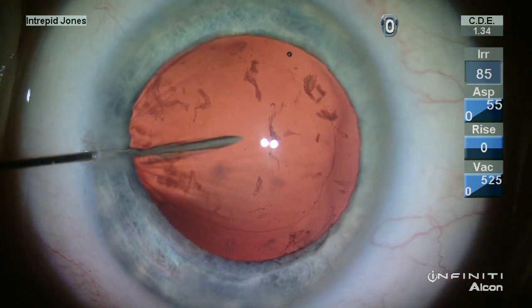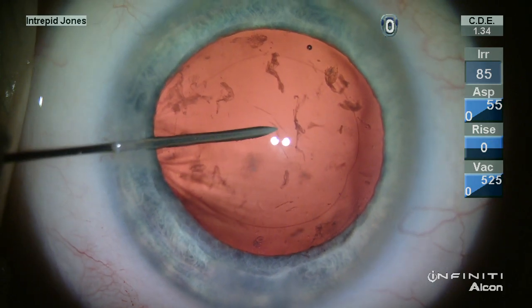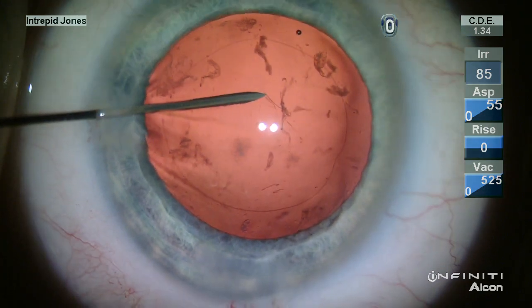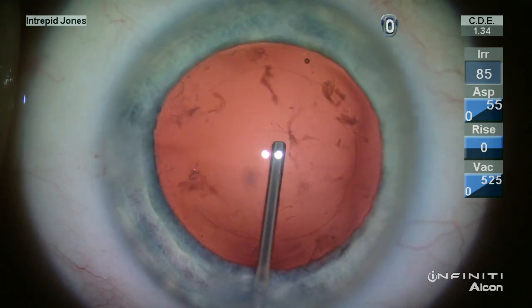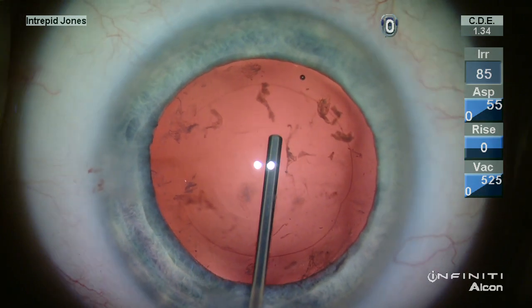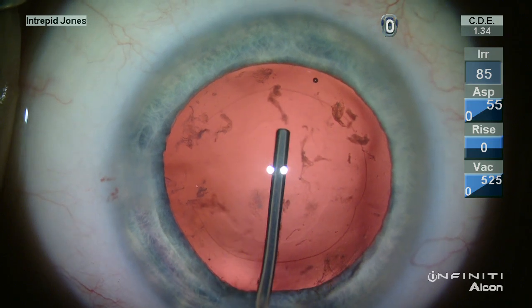You can visualize the liberated material here. Switching to the stereo coaxial illumination on the Lumera microscope, I can visualize the posterior capsule in a more delicate manner and incise it with a 30 gauge needle.